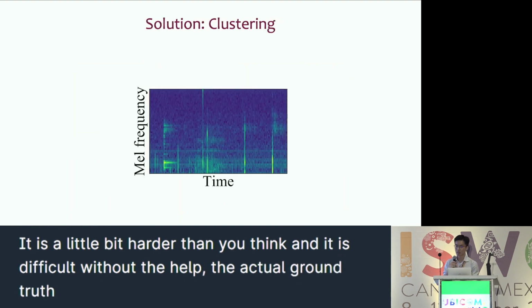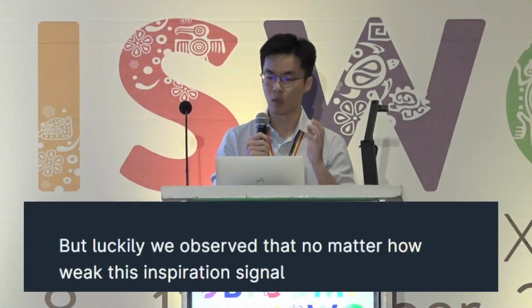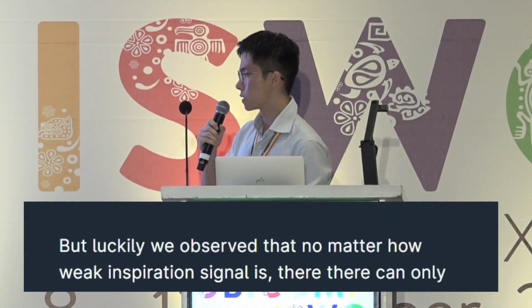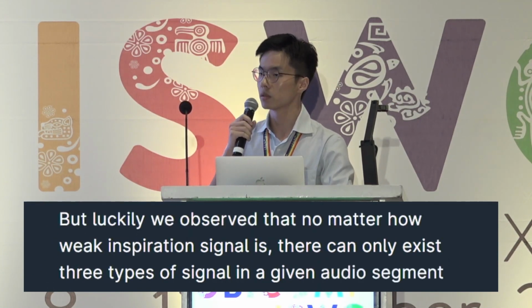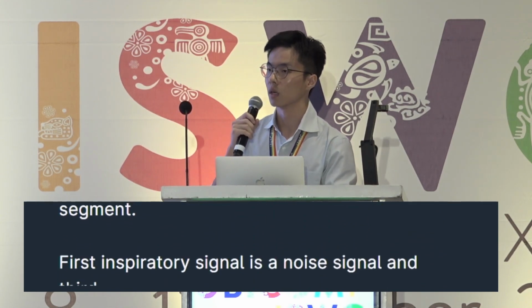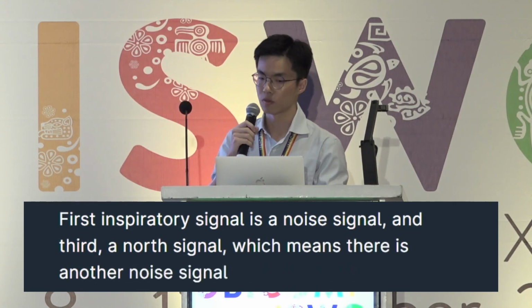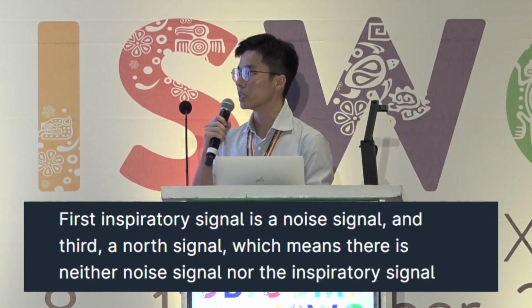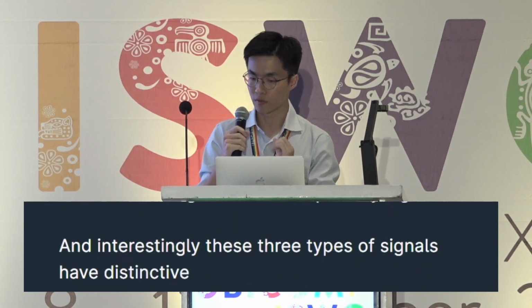But luckily, we observed that no matter how weak this inspiration signal is, there can only exist 3 types of signal in a given audio segment. First, inspiratory signal. Second, noise signal. And third, a null signal, which means there is neither noise signal nor inspiratory signal. And interestingly, these 3 types of signals have distinctive frequency features.